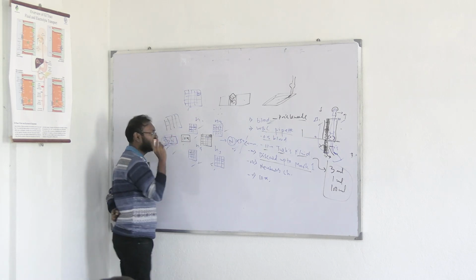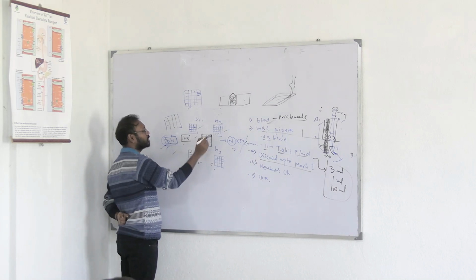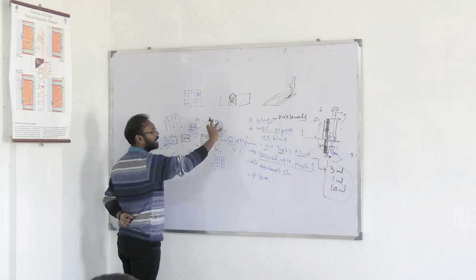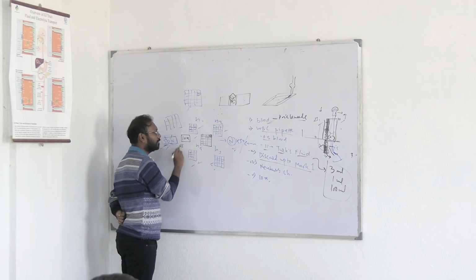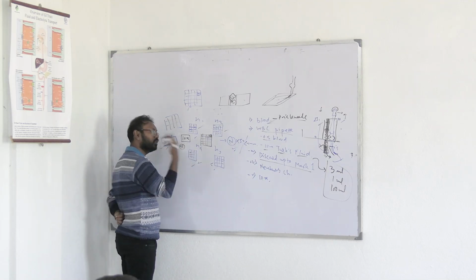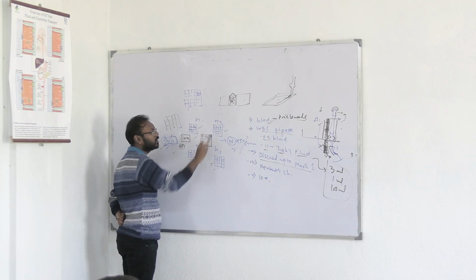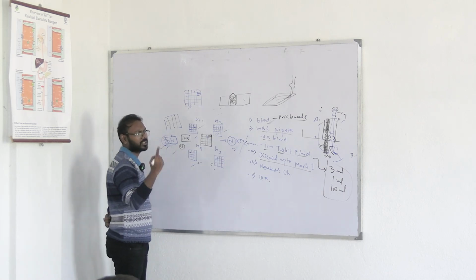But you will not get confused. How will you understand? Because these RBC chambers, though they are 4 into 4, this small chamber, will be visible not as big as those. They will be very small. Only when you get to 45x will these small cells look like these big cells. So it is easily understandable what is RBC and WBC. The cell shape will make you understand that this is not RBC, this is not WBC.